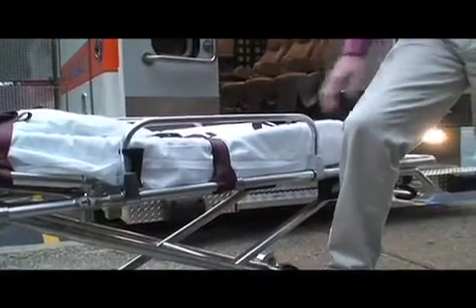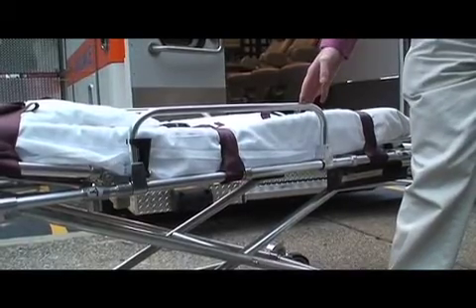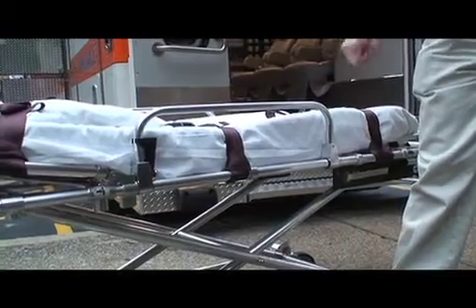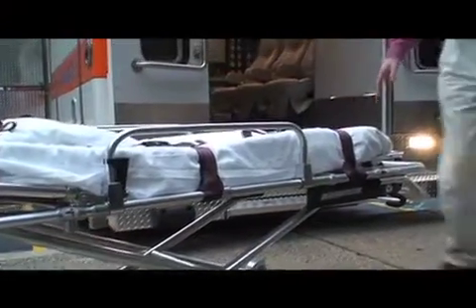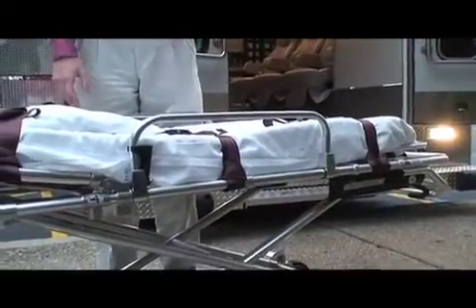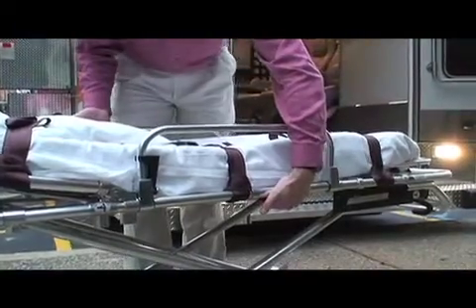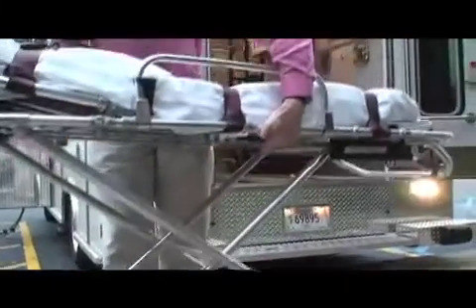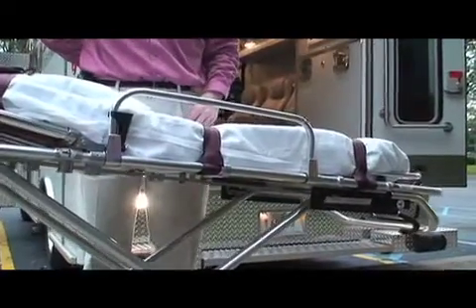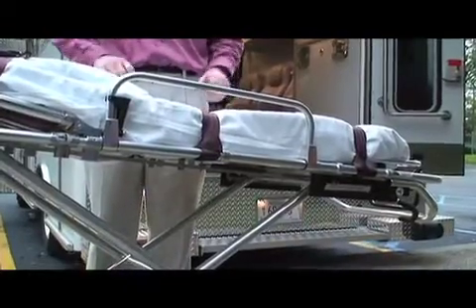Okay? If you choose that method, then as you're going up, you can extend your leg, which pushes out the undercarriage of the stretcher and helps to raise it up so that it's not all upper body. Some people find that difficult, and if you do, and you have longer arms, or find that reaching across the stretcher is easier for you, then you can reach across, squeeze, and then raise the stretcher up. You have to be careful if you're doing that not to hurt your back, because it does kind of force you to bend over. So that's why I prefer the other method.